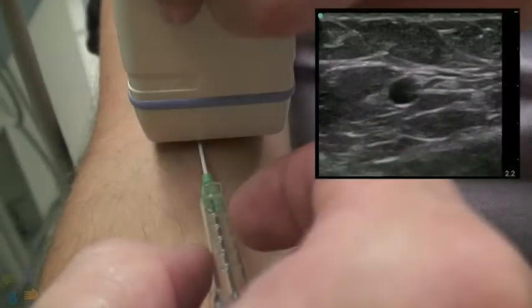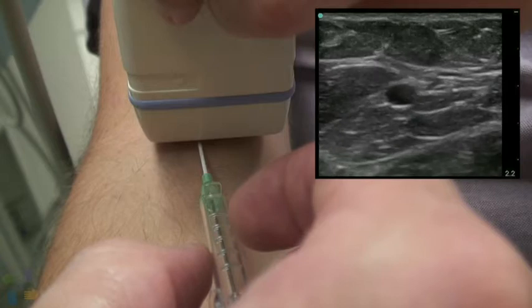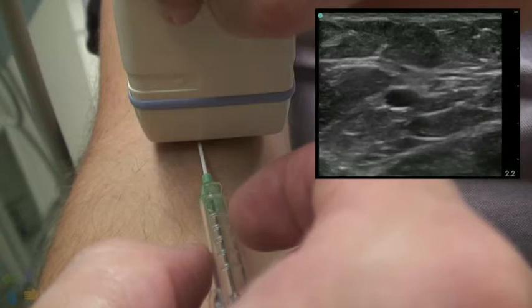With minimal practice, ultrasound-guided IV placement can significantly improve your success in patients with difficult access.